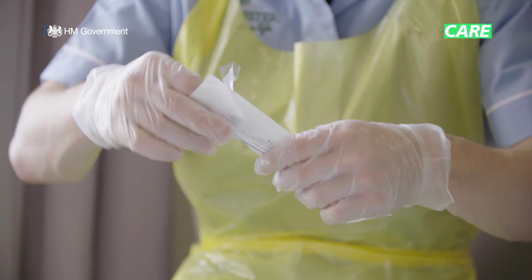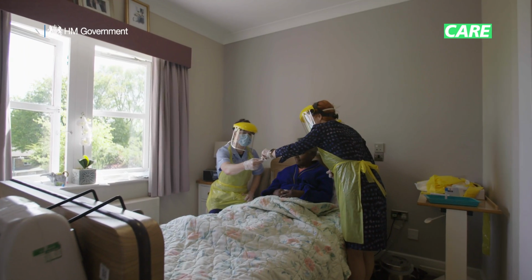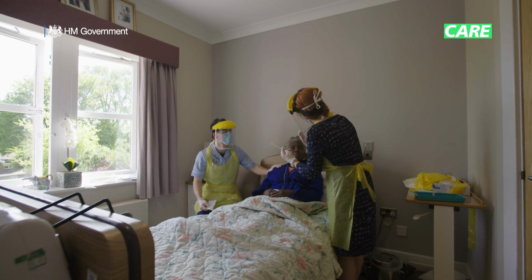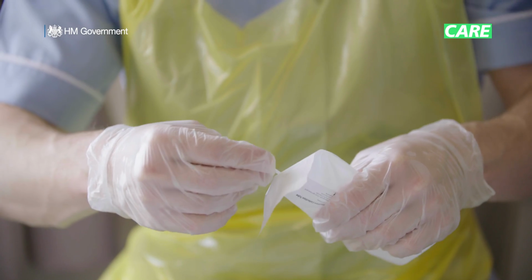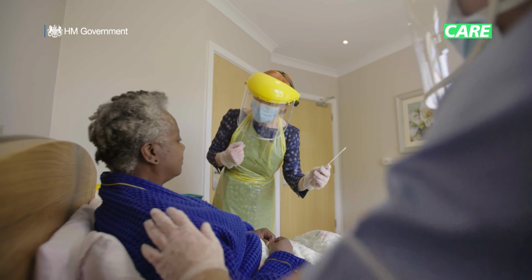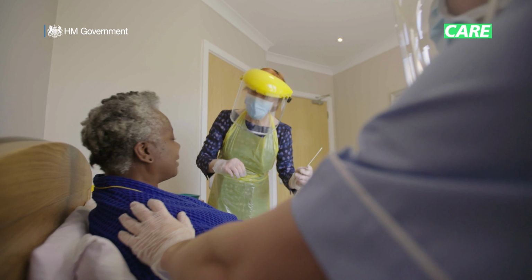Open the swab package and carefully take out the swab. It's really important you take care not to touch the tip of the swab to avoid contamination. If you do touch the tip during this process on anything you're not meant to, please start again with a new swab. This swab will be used on both the person's throat and nose.